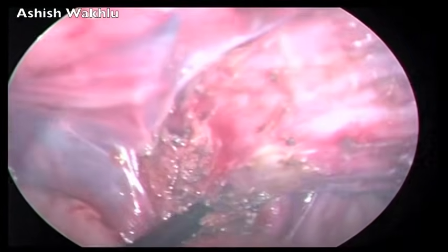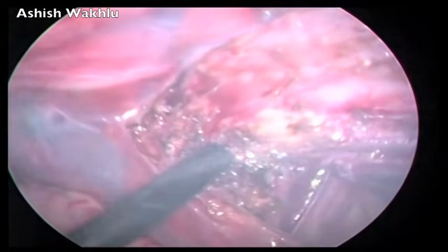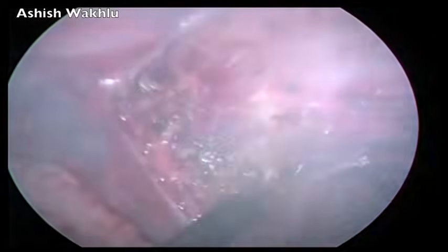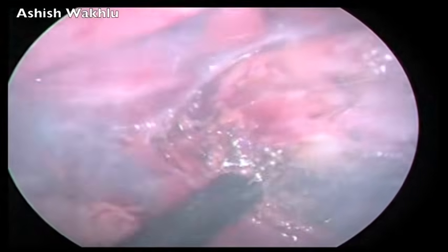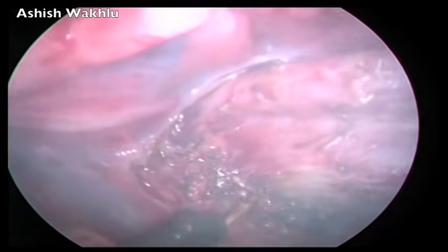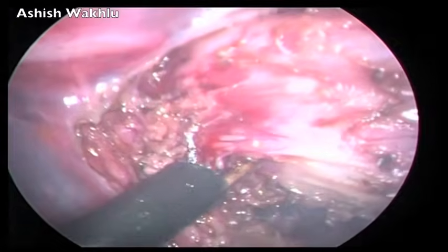Once you've got the gap and the posterior limit of the rectal wall clearly delineated, as we can see here, one can be a little braver and cut through thicker bites of tissue. However, it's still better to be careful.